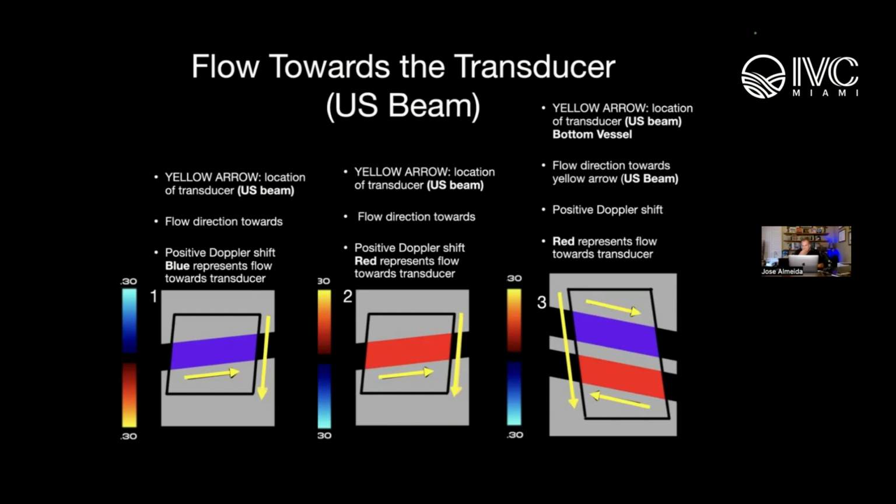So let's keep going. I keep harping on that because when you've got somebody standing, some people scan with the saphenous vein in short axis and try to determine reflux. Of course, that's not ideal. But then you lay them down, and the folks are asking, which way is the head? Which way is the foot? Why is the artery blue here? Why is the vein red? How do I steer the box? What do you mean towards the transducer? The transducer's on the skin. That gets confusing for people, and even the left and right and up and down, they can't orient with the probe in their hand.